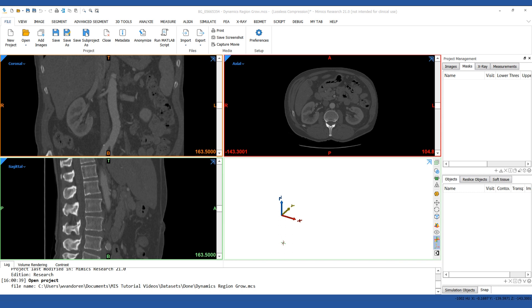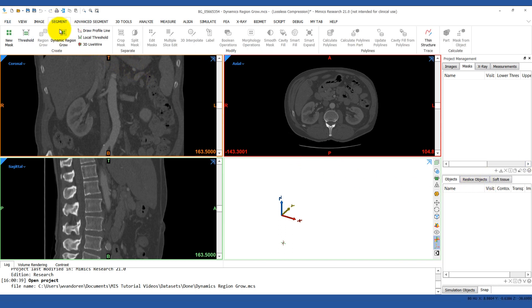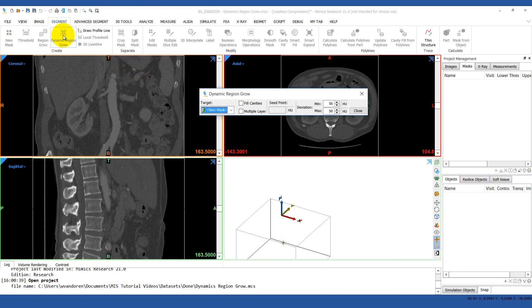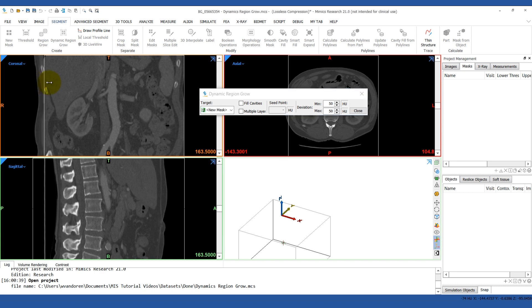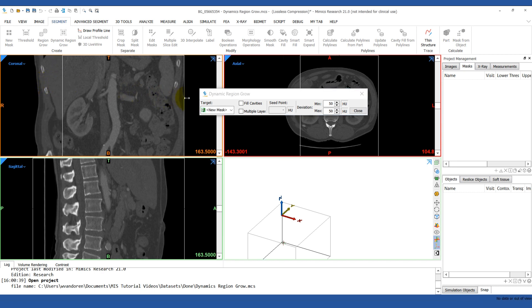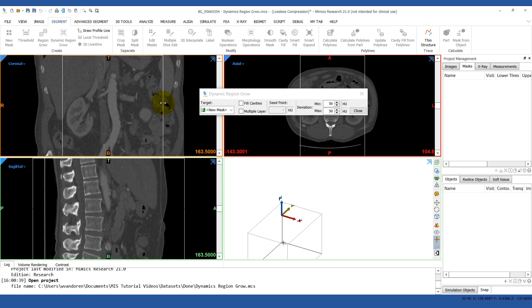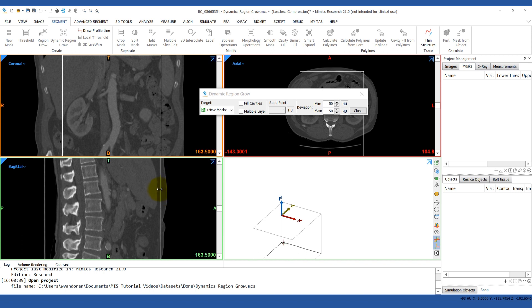To start, open up the segment tab and select the dynamic region growing tool. The first thing you will have to do is crop the boxes to the region you're interested in. In our example, we want to segment out the abdominal aorta so we're just going to crop it to that region.